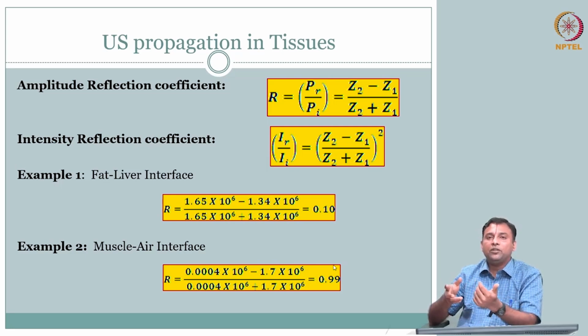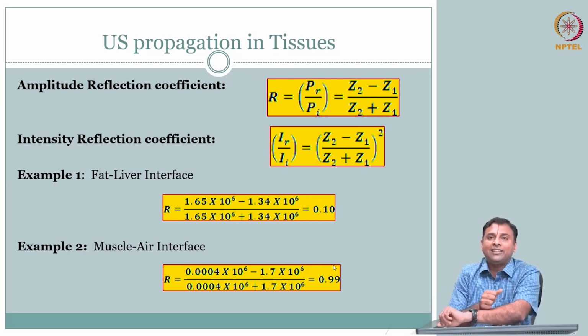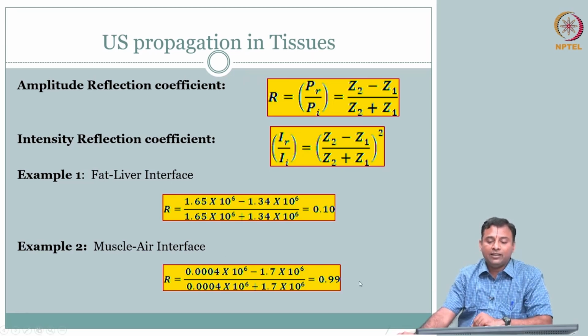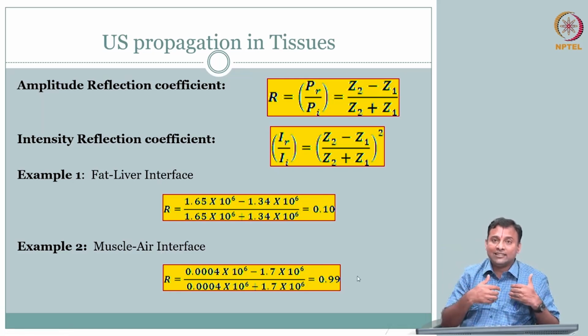So what they typically do, if you have been for an ultrasound imaging, is they put some acoustic gel, coupling gel they call it. The acoustic gel displaces the air, then we have this wave generator placed in that gel, so that the ultrasound that is generated goes through the gel and goes through the tissue. Therefore, you do not have air in between. If you have air in between, you will have an air-muscle interface and you will not be able to penetrate inside the body.